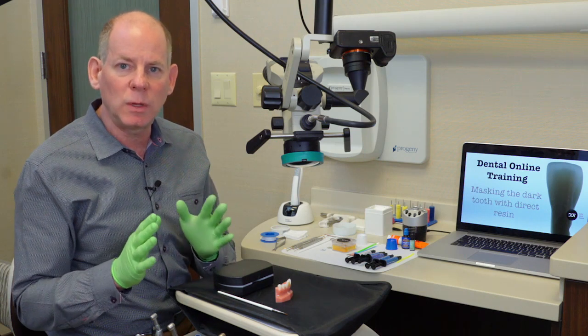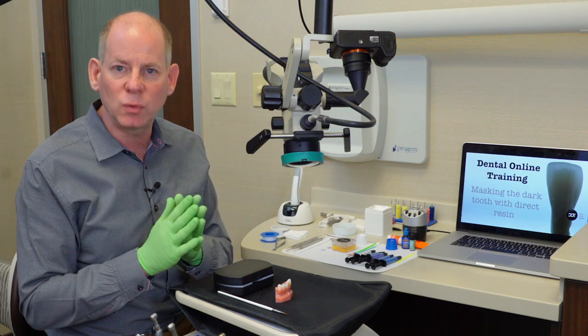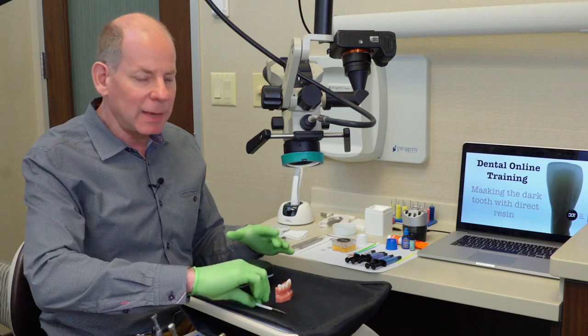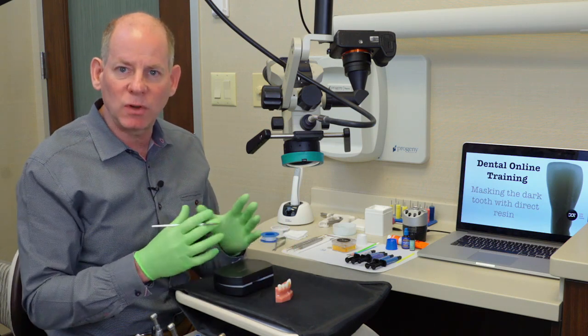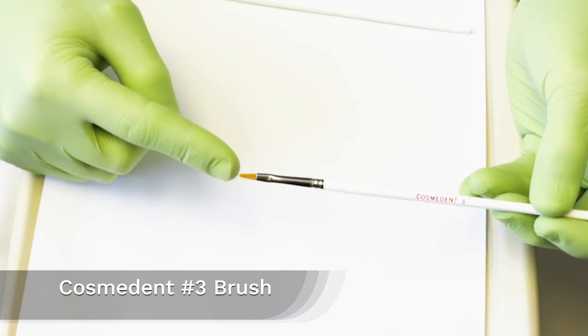This is the only place where I use the pink opaker — in the sub-opaking, or on the tooth structure when I'm blocking out dark teeth like this. Because I'm going to be opaking over such a broad area, I want to use a larger brush, so I'm going to use my number three Cosmedent brush.